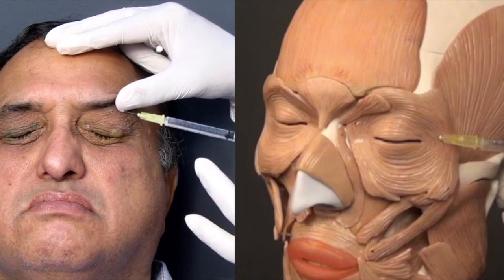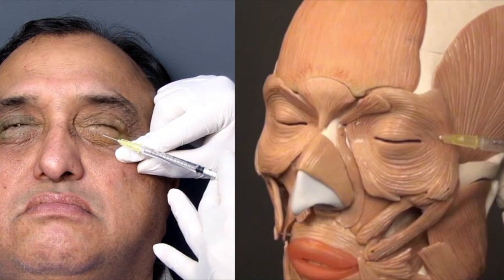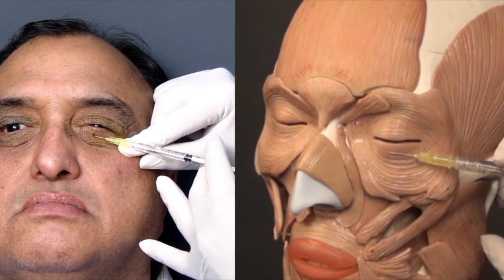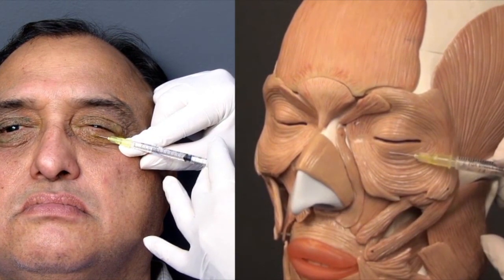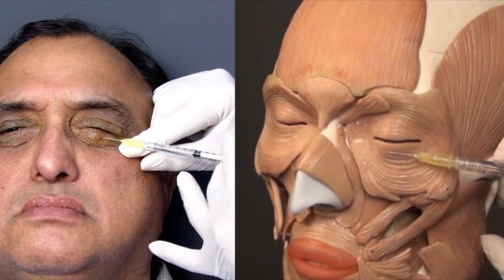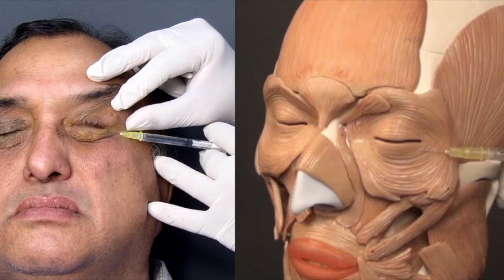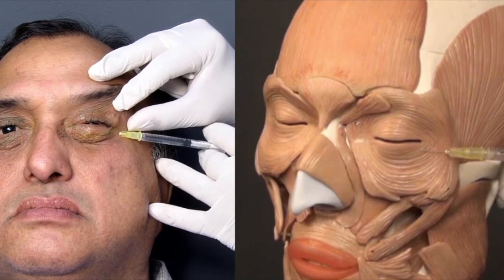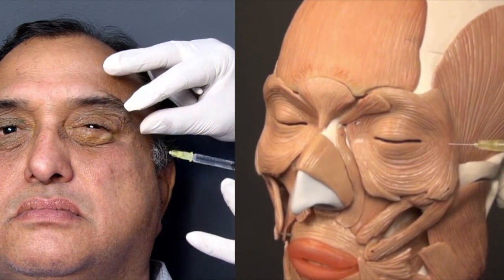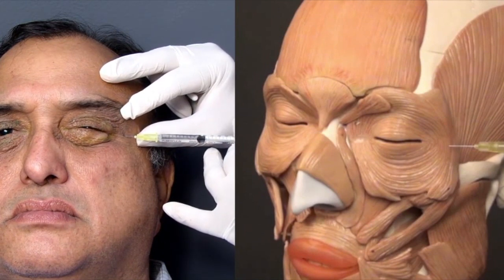The eyelid does not have fat below the skin, so if you inject subcutaneously you can directly load the injection onto the muscle. I am now giving the mid-pupillary injection in the pretarsal region, just going to hub depth of the needle, injecting, and coming out. My non-dominant hand actually keeps the eye open, so even if the patient suffers a spasm during the injection it does not interfere with the injection process. Each site is receiving 0.1 ml with a 30 gauge needle.